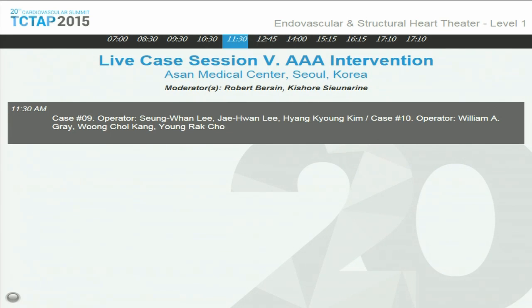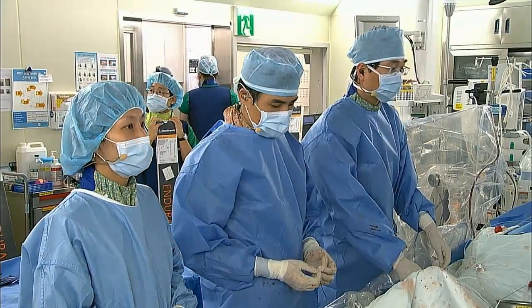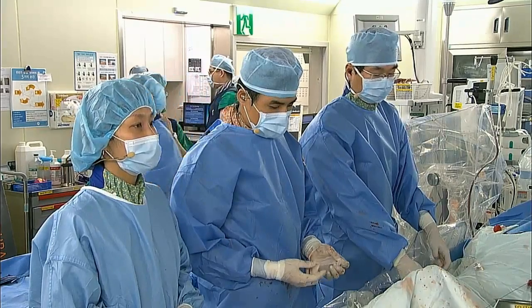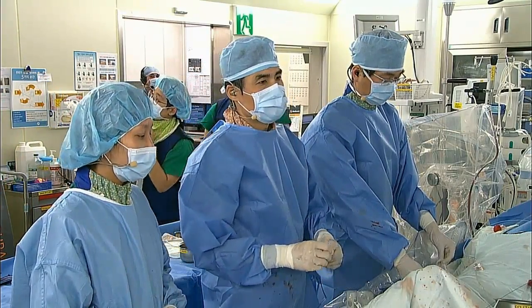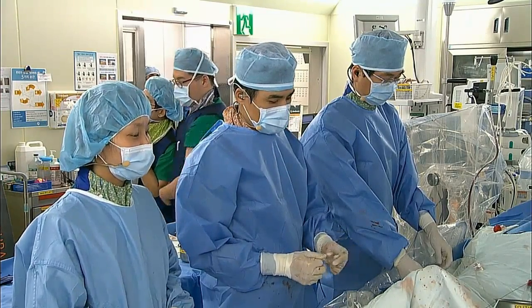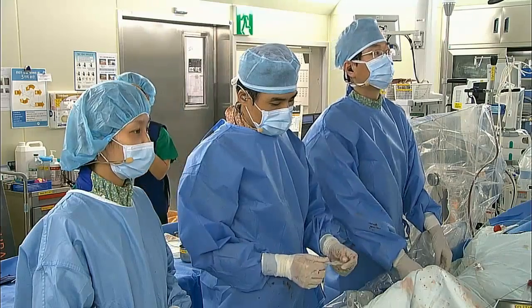Okay, good morning. We're continuing our sessions here in the Endovascular Theater, and we're now going to a live case demonstration session on AAA endovascular therapies from Asan Medical Center. I'm Bob Bersin, your moderator, and I'm also joined by Dr. Kishore Sieunarine. Welcome. And we have a distinguished panel, and I understand we're going now to Asan Medical Center live.